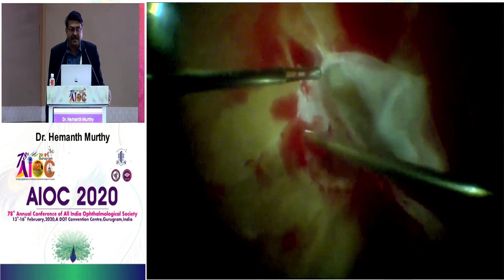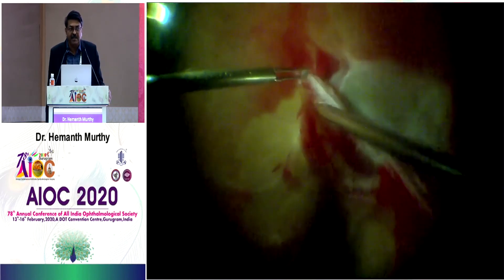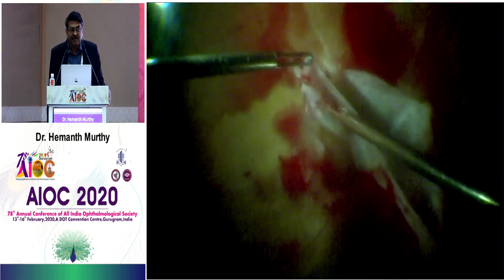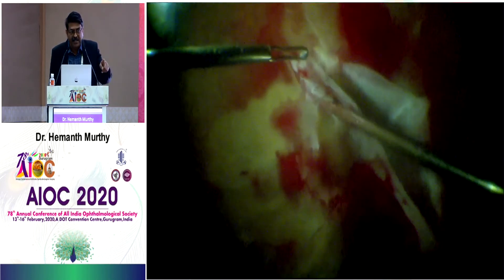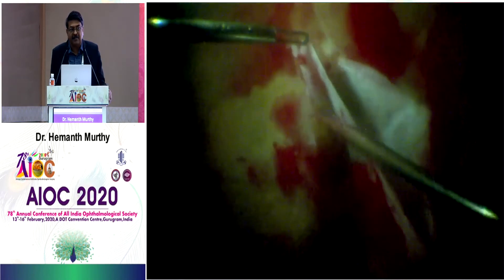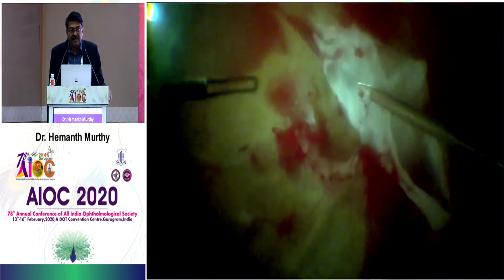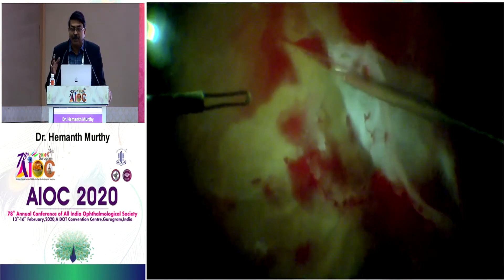You can see that all the blood vessels are also spared — I'm actually sparing the arcade blood vessel there. Bimanual surgery is extremely useful in this situation. As I come towards the macula, I can dissect it without causing trauma to the retina. This is one good way of doing it in broad adhesions.